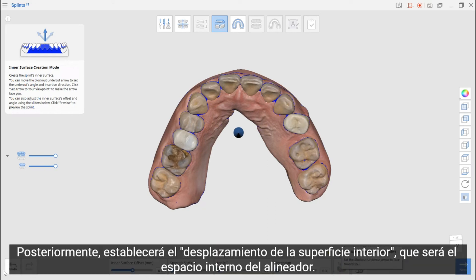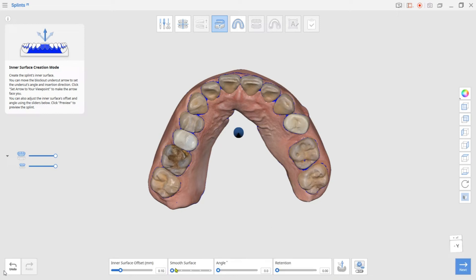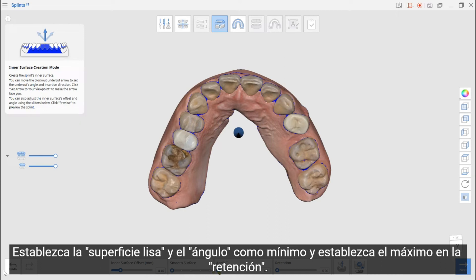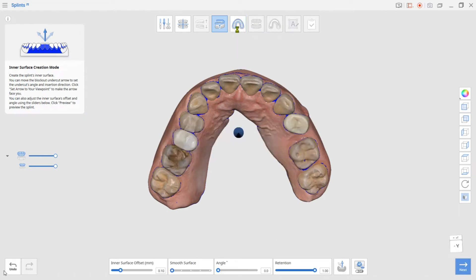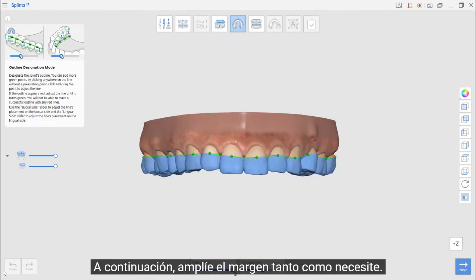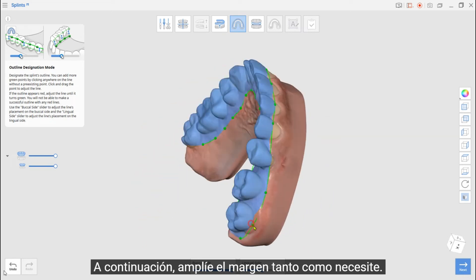Later you will set the Inner Surface Offset, which will be the internal space of the aligner. Set Smooth Surface and Angle as Minimum, and set Maximum on the Retention. Next, extend the margin as long as you need.